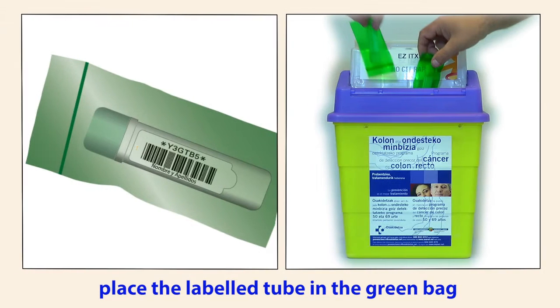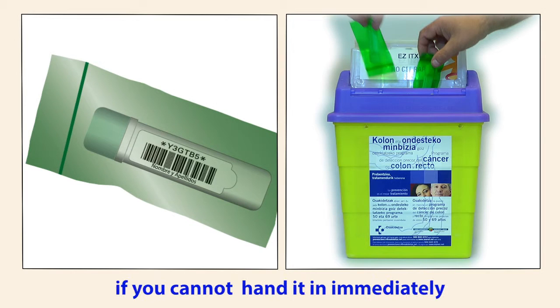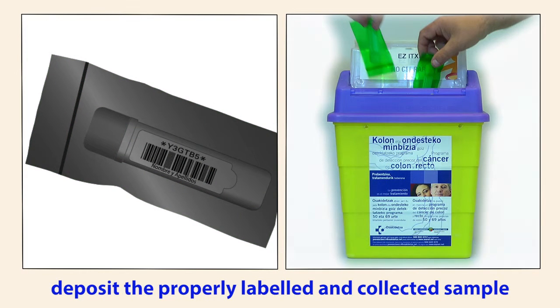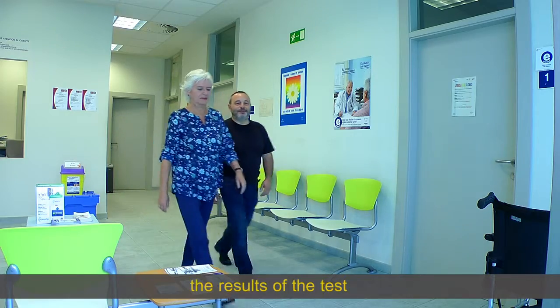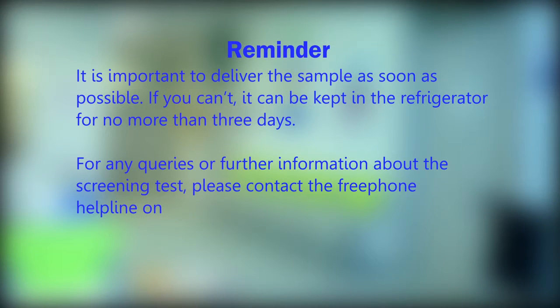Place the labelled tube in the green bag and take it to your health centre as soon as possible. You can leave it in the refrigerator for a maximum of three days if you cannot hand it in immediately. Deposit the properly labelled and collected sample in the container at the entrance to your health centre. The results of the test will be sent to your home address within 10 days. We recommend that you use the test kit within four weeks after receiving it.